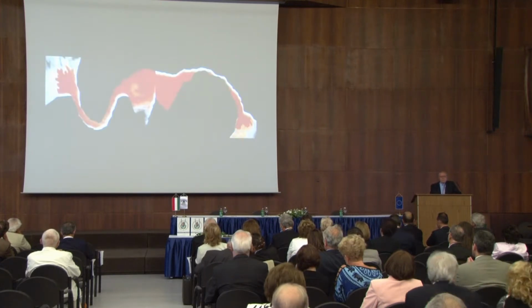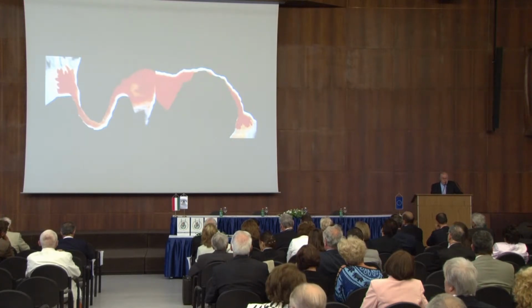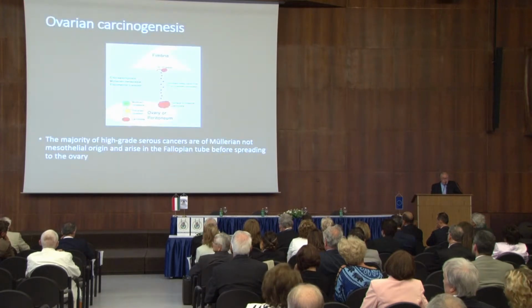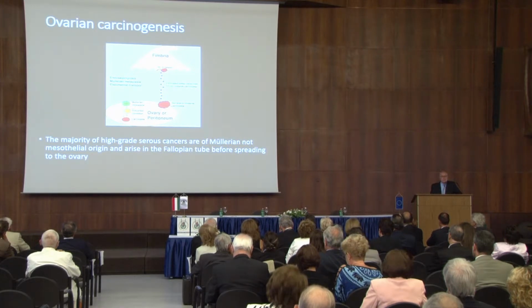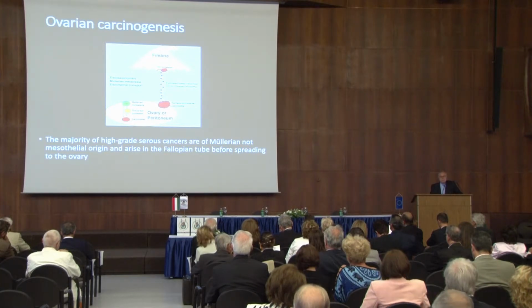We shouldn't forget the fallopian tube. The fallopian tubes are frequently the place of sactosalpinx, of hydrosalpinx, of inflammation. You see that this new technique visualizes the full length of fallopian tubes and uterus together, and a very recent hypothesis, from 7 papers published in prestigious journals, is that for ovarian cancer, the most disappointing part of modern gynecology, early diagnosis does not exist. It's just a matter of chance rather than the triumph of any scientific method. And we are looking for a screening method, and every one has failed. There are about 80 attempts, with computer, without computer. None is better than the subjective assessment of an experienced expert who will say yes or no, it is ovarian cancer or not.